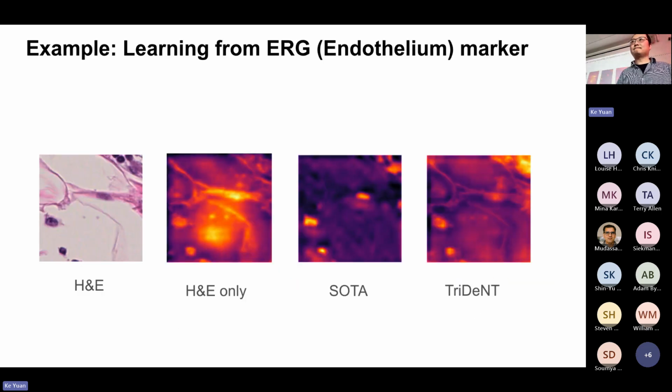Yeah. So what is it essentially picking up over here? Because you are only training on the color, isn't it? But that's a vacuum over there. So what is there in the density? This is the adipose tissue, where you also have endothelial cells in the middle. So a well-trained model should be like this, right? Yeah, it should recognize the adipose tissue architecture. It should also recognize the cells that are there. Depending on different contexts, they will have their values.